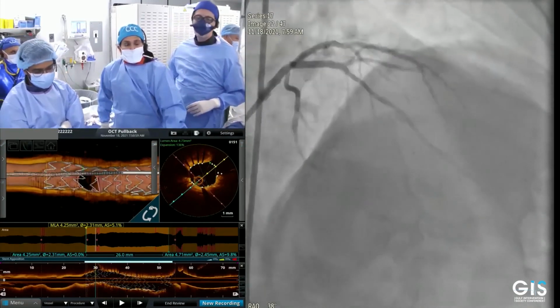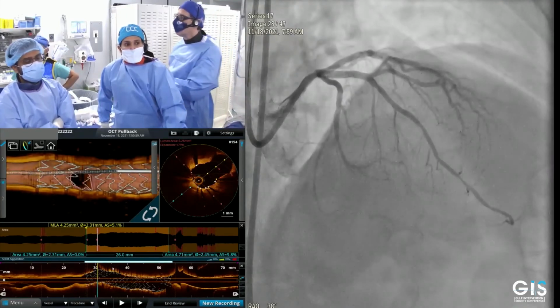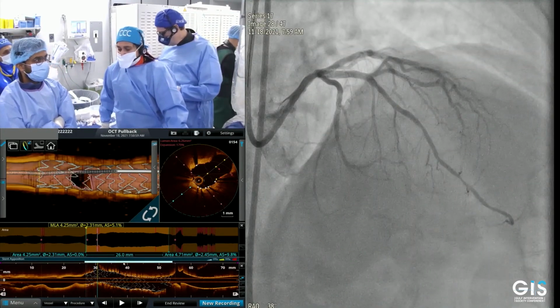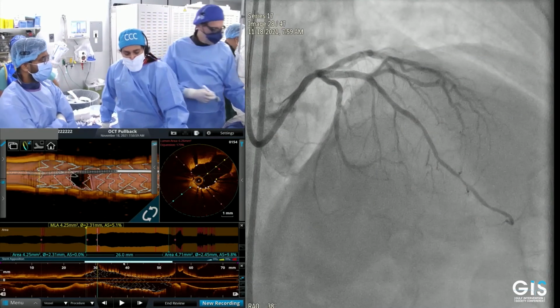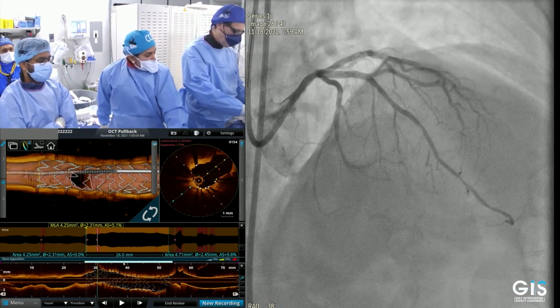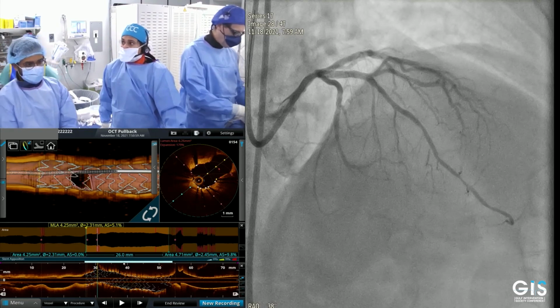Can I ask an up-to-date question? Normally I ask people, if you want to know if your stent is being appropriately deployed, you've done the imaging, what about the FFR, IFR here? Physiology. You want to check that as well? No, I don't think so. No need? Then why do we teach this? We say you do FFR, IFR after the stenting. But here there is very good flow, good myocardial blush. People talk about UFR, OFR, the combination of the two together is the whole to get everything optimized, physiology and imaging.